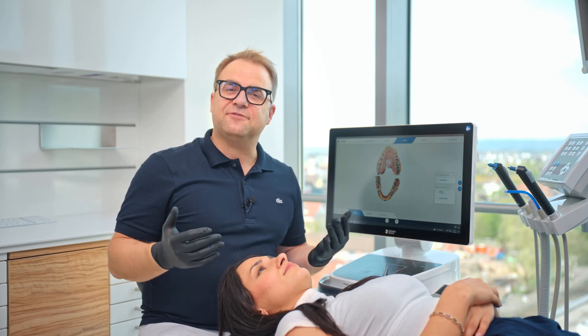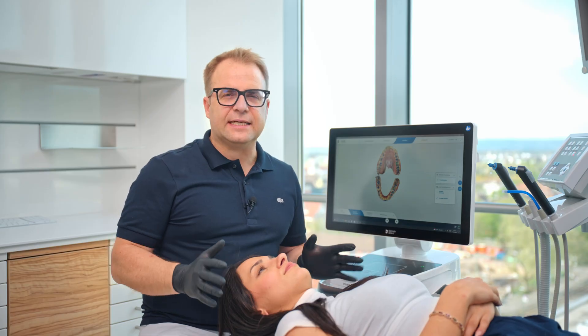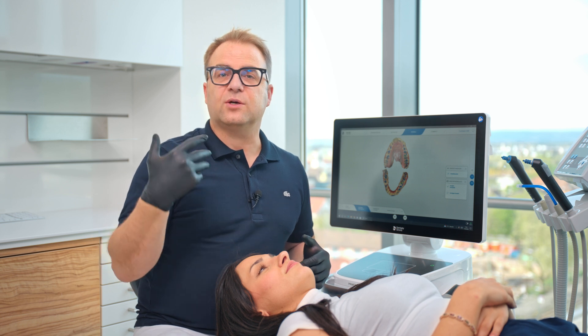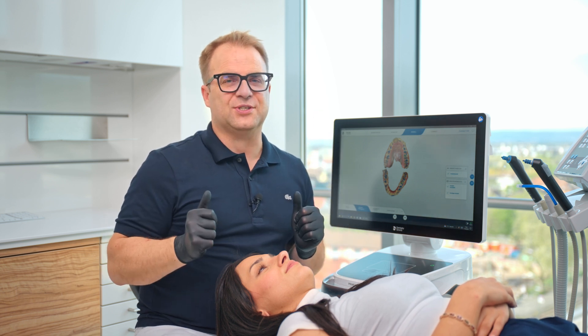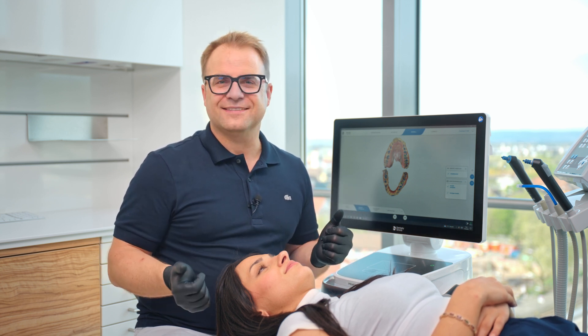Here we have it — a comprehensive intraoral scan: quick, easy, and highly reproducible. Intraoral scanners are at the forefront of digital workflow efficiency. They capture detailed data quickly and in high resolution, making it easy to create accurate 3D models for a variety of clinical applications. They empower us to work more efficiently and make the collaborative process smoother and safer. Their data lay the groundwork for treatment planning and case presentations. In the next step, you will learn how to add motion data to your digital avatar, opening doors to dynamic occlusal analysis and beyond. Stay tuned.